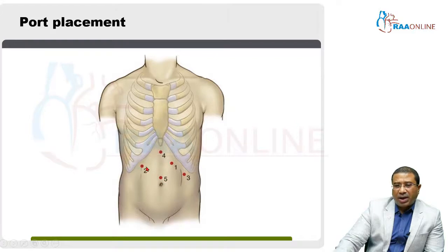Then right and left pararectus, you have, this is your left hand working, this is your right hand working. You have an epigastric port for liver retraction, and then you've got an accessory port for traction of the stomach.